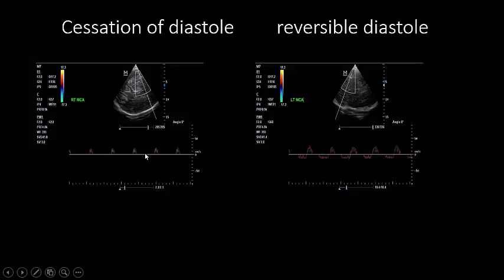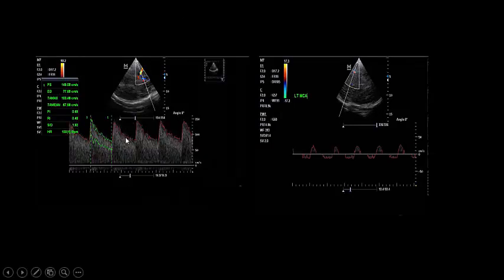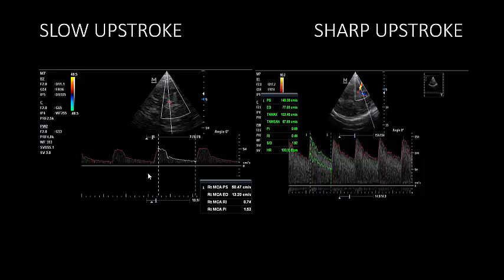This is the transcranial Doppler in a patient with brain death. You see there is systolic flow but loss of diastolic flow, and in some cases reversal of the diastolic flow. This means that during diastole there is no flow to the brain, which is not acceptable in a vital organ. This is because increased intracranial pressure is interfering with blood flow during diastole — a very bad sign denoting severe increase in intracranial pressure.